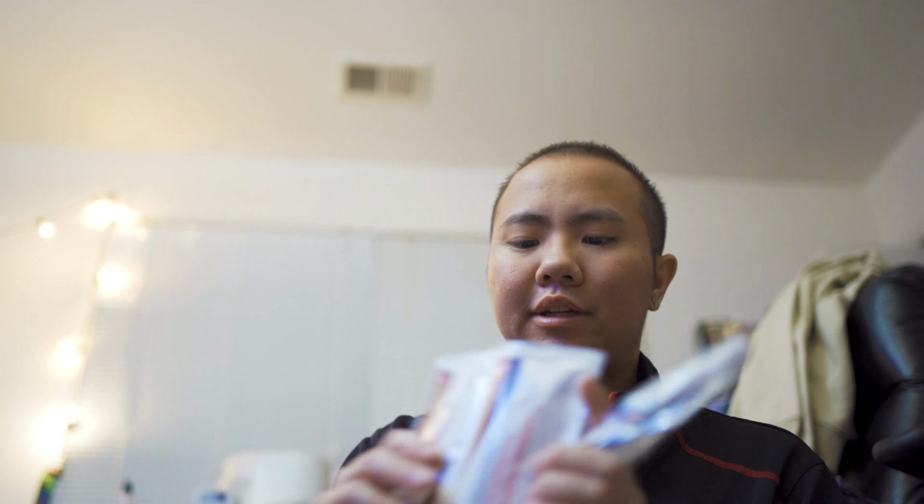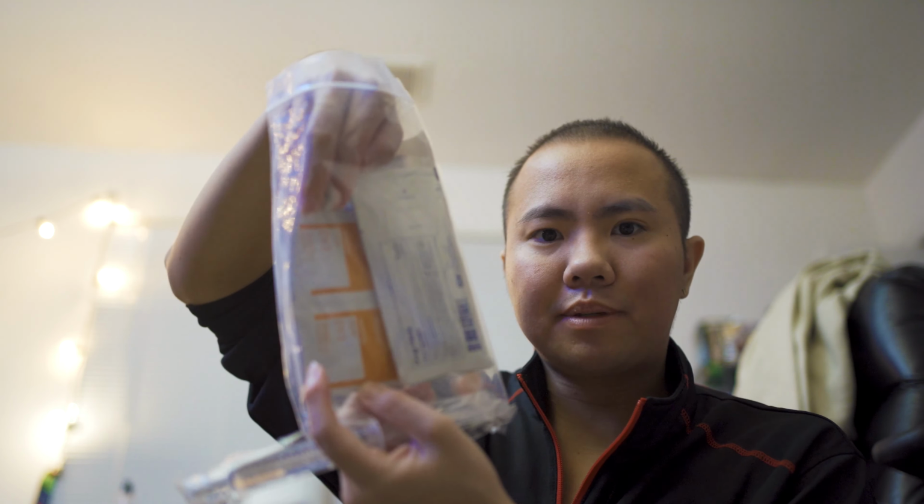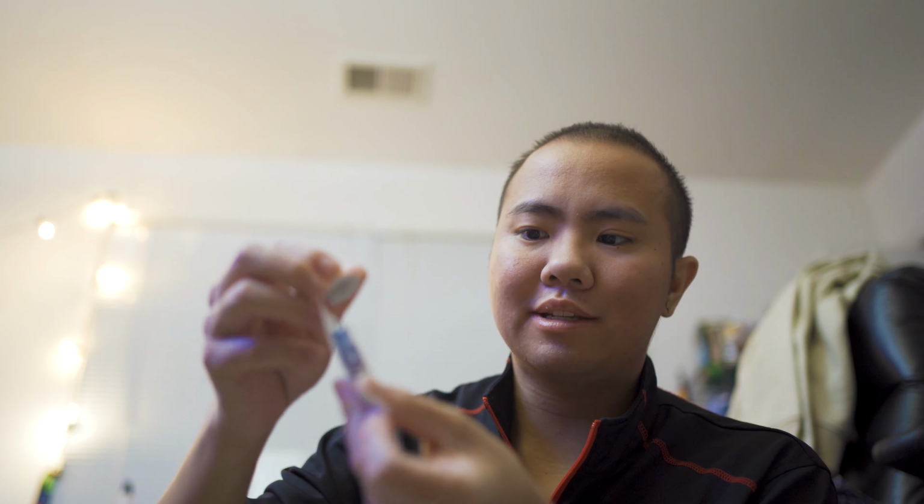So in my emergency bag, I have a saline flush. I have a central line change with Tegaderm dressing, gauze, some betadine packets. Some people use ChloroPrep, but I'm allergic, so we use betadine. And alcohol pads, alcohol preps. And then you have these alcohol caps. These little things go onto your main cap, and it just screws on, and it keeps it very sterile.